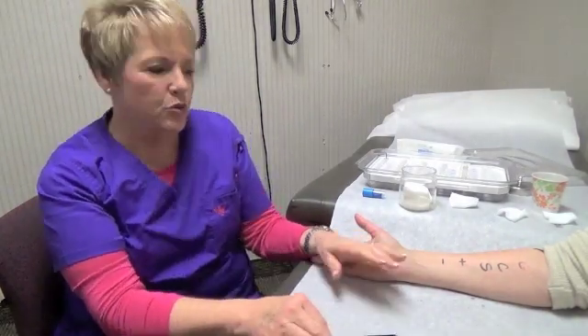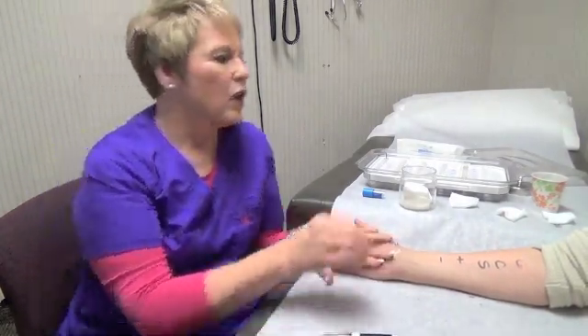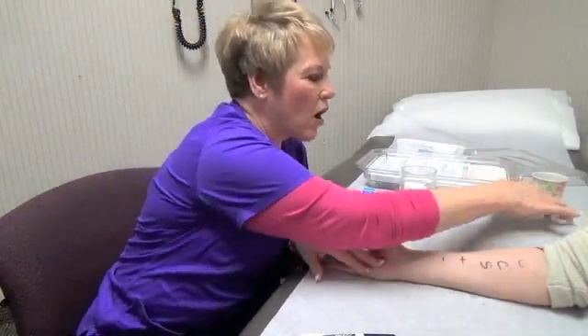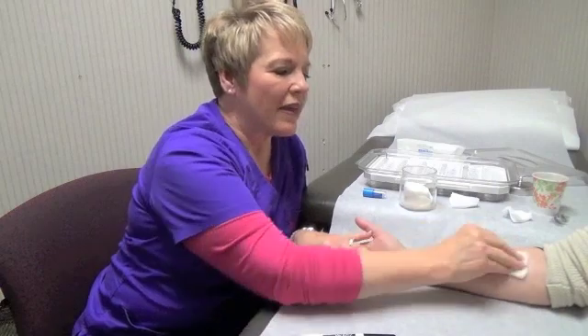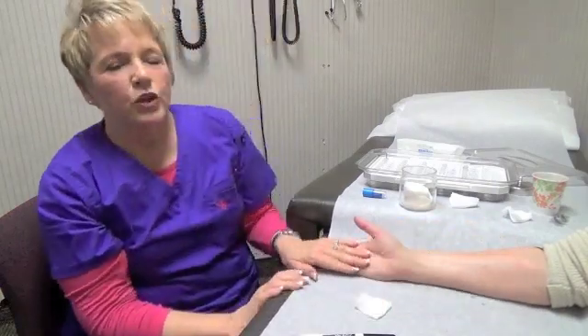Once all your test results are read and recorded, we cleanse the site with alcohol and then we apply an anti-itch gel. At this point the doctor will come back into your room and discuss your test results and a treatment plan for your care.